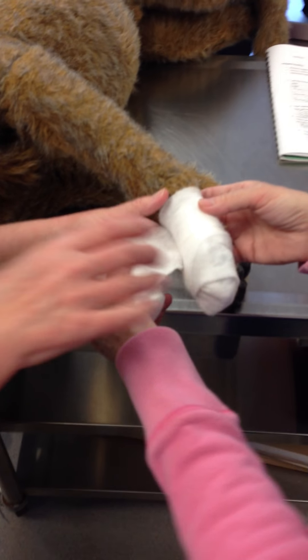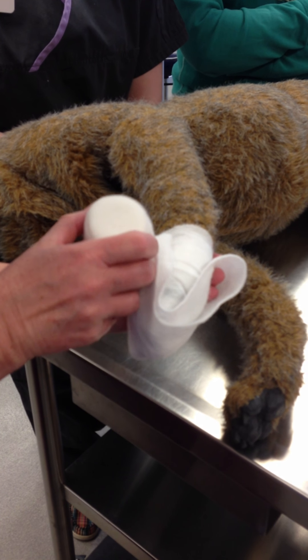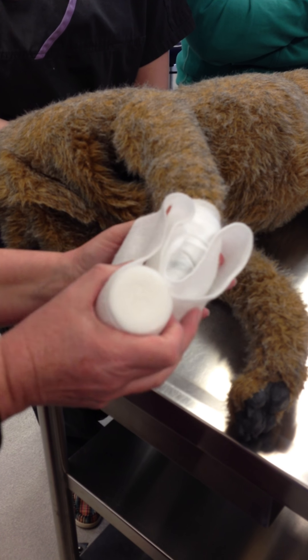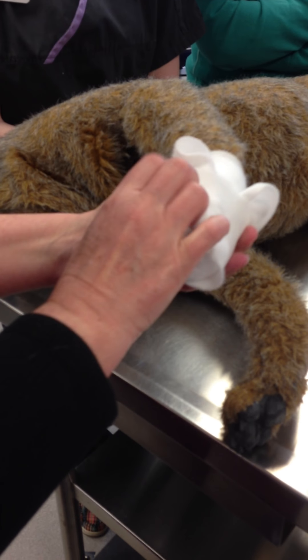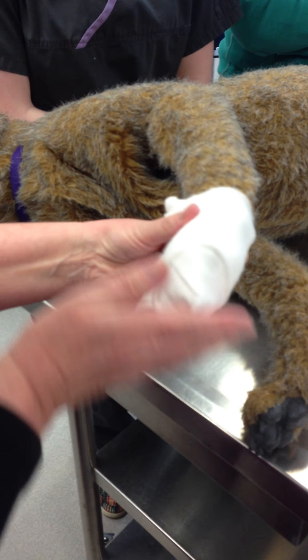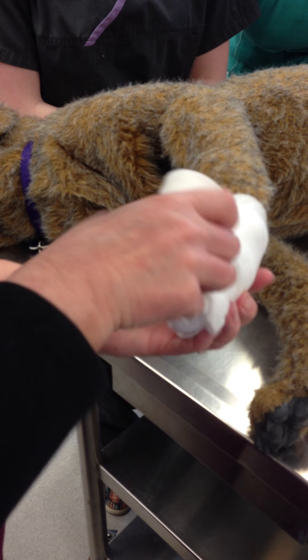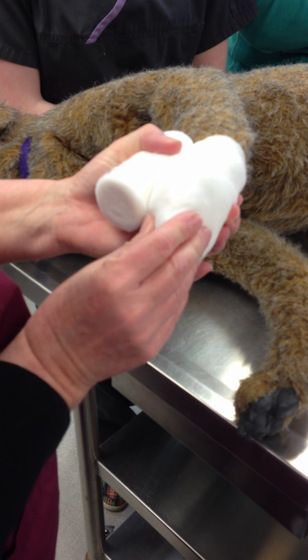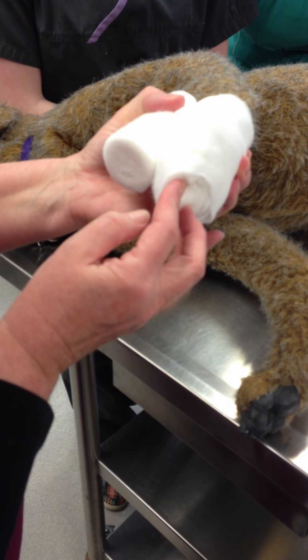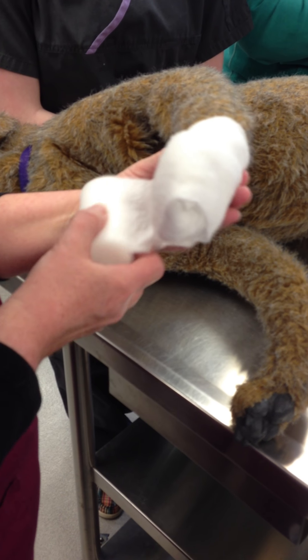I'm just going to do this bit to show everybody what I do. At this point I loop it around my thumb and go over the toes, come back down and then turn it over so I can roll, going back up and incorporating all that padding. That gets lots of padding over the toes themselves. I'm quite generous with my padding because I want this to be comfortable. I want there to be enough padding on here that when I start palpating anatomy, my anatomy is getting a little bit uncertain, and then I know that I have enough padding.